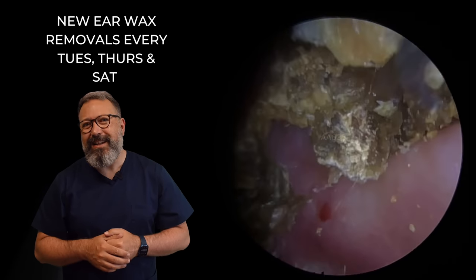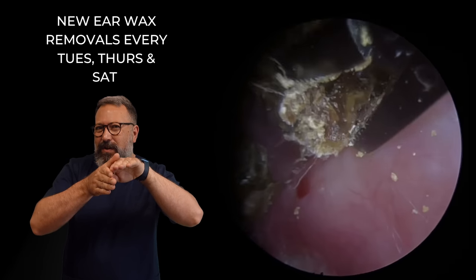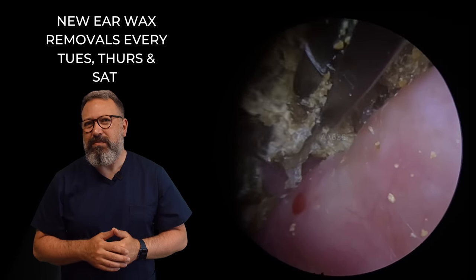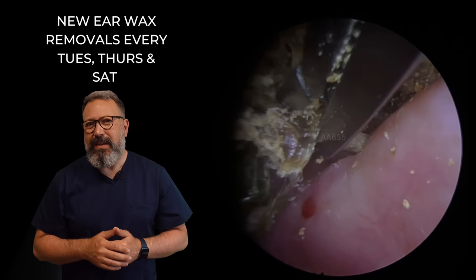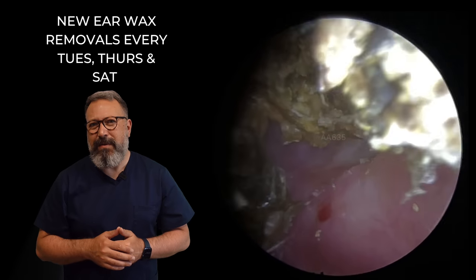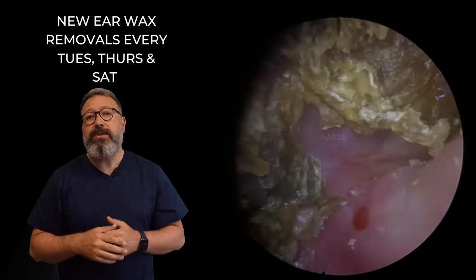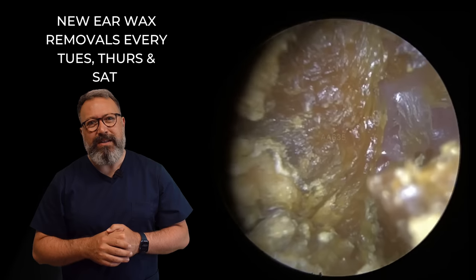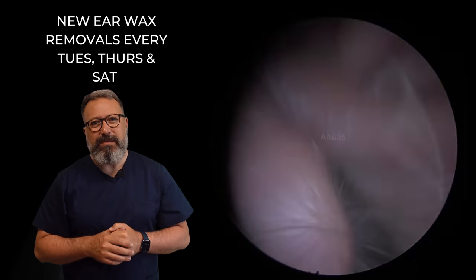There we go — we're starting to see that ledge. Can you see just the ear canal just tailing off to the one side? That's that ledge we were talking about there. I'm just trying to get a good old grip on this piece. There's a little bit came out there — brilliant. Now we can start to see that ledge going over the top. Where can we work next? Where can we get behind this piece? There's a little ledge there we could possibly exploit.